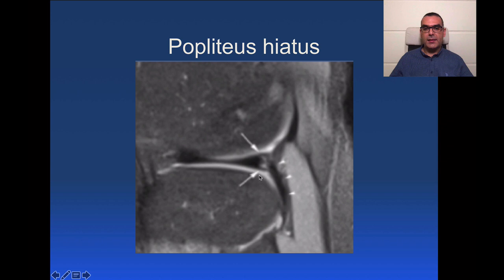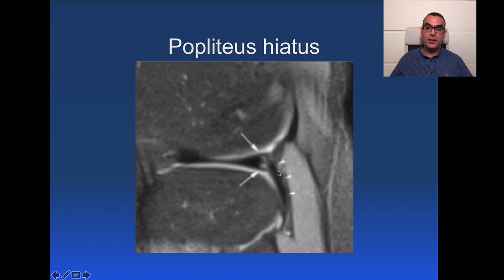Next is the popliteus hiatus. The popliteus tendon passes right behind the posterior horn of the lateral meniscus within the meniscal-capsular attachment, and this defect is called the popliteus hiatus. This should never be mistaken for a peripheral meniscal tear.